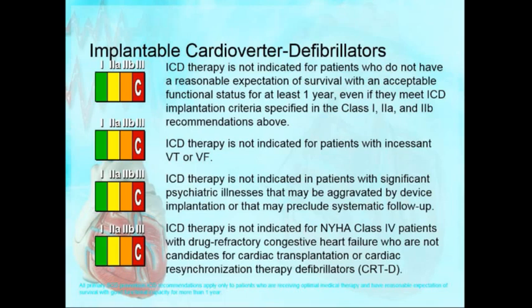Yeah, it's like a pacemaker, a dual. Correct. That's a very good question, actually. It's a constant dilemma that we run into. You have a pacemaker, defibrillator, and BIV, right? As you go up, it's phenomenally expensive. Very, very expensive.